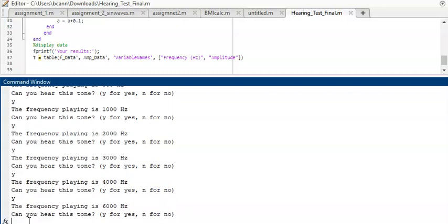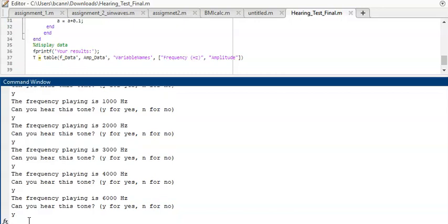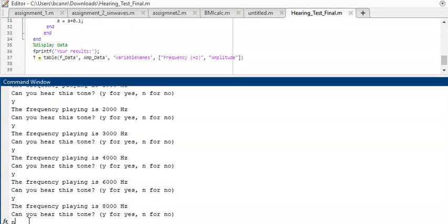So each time the user inputs a Y or an N to demonstrate yes or no, the sinusoid will either increase in amplitude so that they can hear it, or it'll increase the frequency if they already did hear it. So when we enter a no, the amplitude has increased, and then enter a yes or no again.